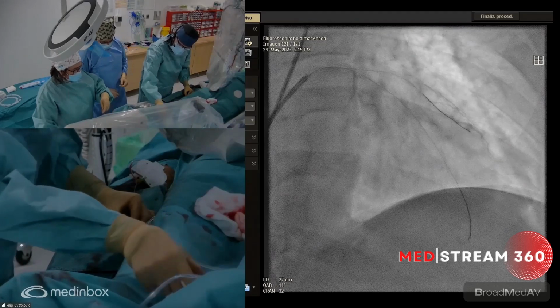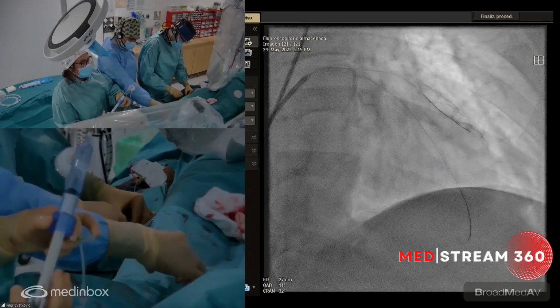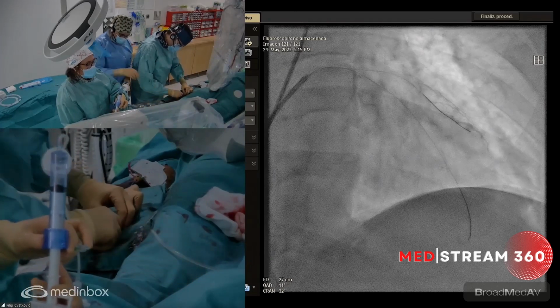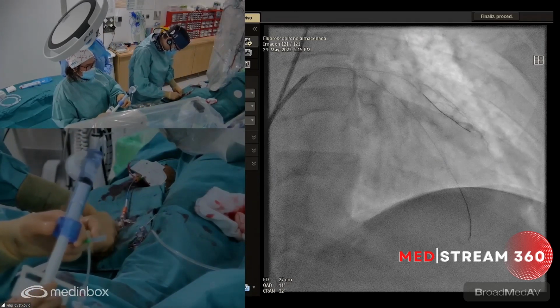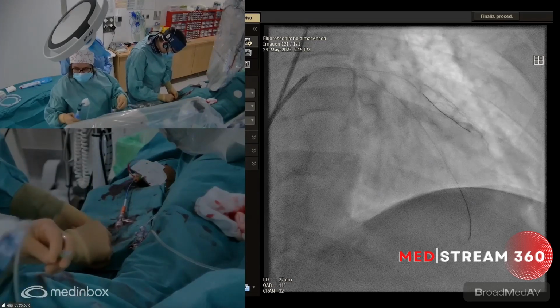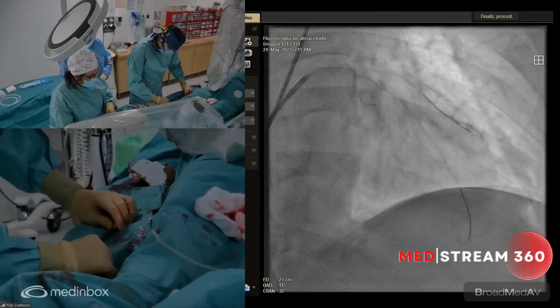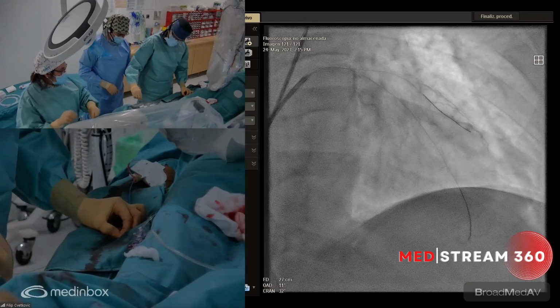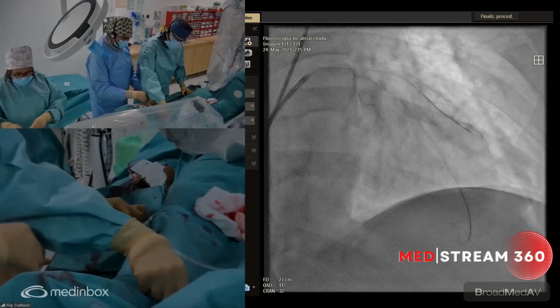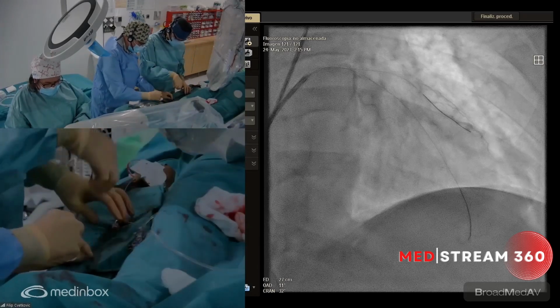Just to remember, it's a balloon with 2 emitters connected to an electric source of energy that transforms this electrical energy into sonic waves that pass through the soft tissue and modify the calcified plaques, not only the intimal or superficial calcium, but also the thicker plaques, and the calcium in the media.